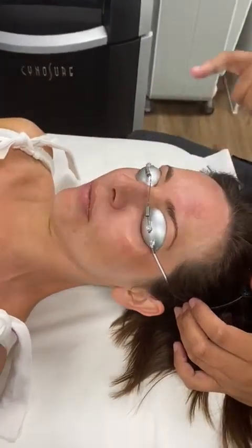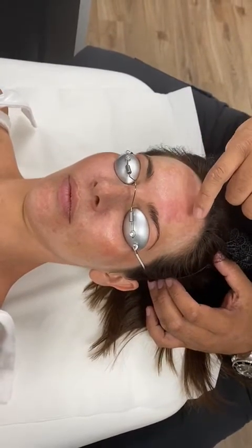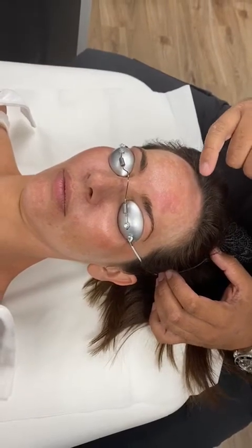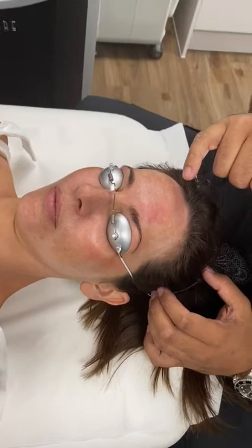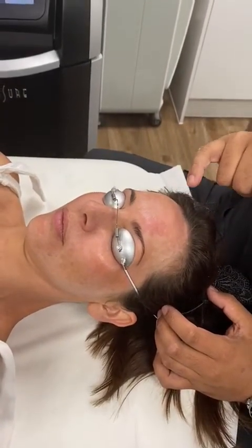What we're going to be using today is a PicoSure laser. I've done a little small preliminary area — you can see this enhanced erythema here. We're using a 755 nanometer wavelength, which is much more melanin specific than any other picosecond laser available.